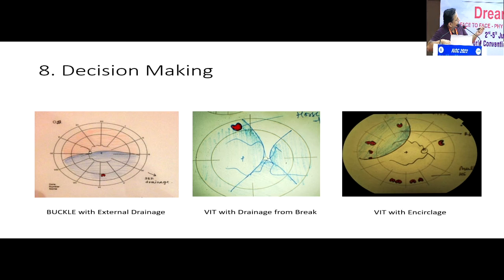I'll just see there's a small HST and it is following the Lincoff's rule, and so I'll just do a vitrectomy with drainage from the break site.